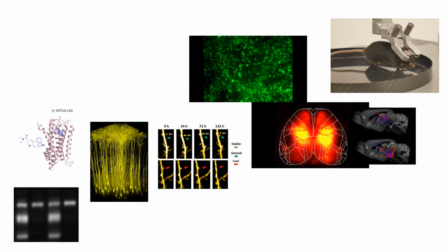As I mentioned, the animal is awake and behaving during the experiment. The fluorescent indicators allow us to image the neuronal activity at the level of individual neurons or networks at the same time as testing behavior. We can also look at morphological plasticity using dendritic spine turnover. And the only step that does require sacrificing the animal at the very end of the experiment is the step where we do biochemical and molecular biological analysis of the protein levels, protein expression, phosphorylation, etc.